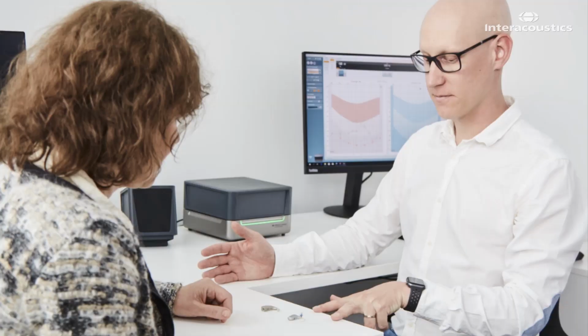The hearing aid transition feature has been created to help you retain the patient's audibility preferences from their current hearing aids during the upgrade process. It allows you to make measurements on their existing hearing aids which will later be used as a target to fit the new hearing aids. This is beneficial when considering a few scenarios.